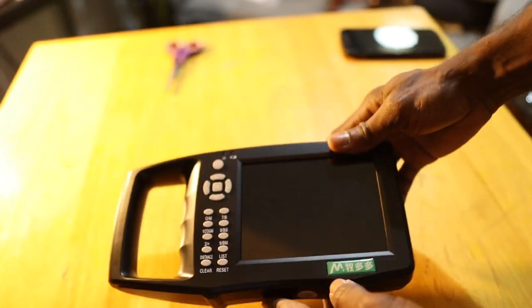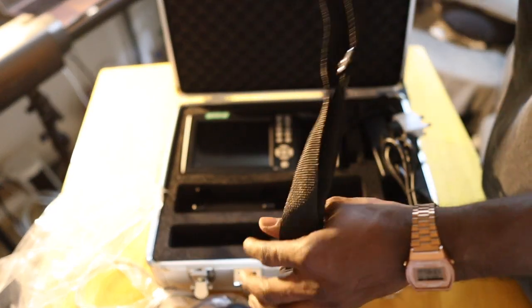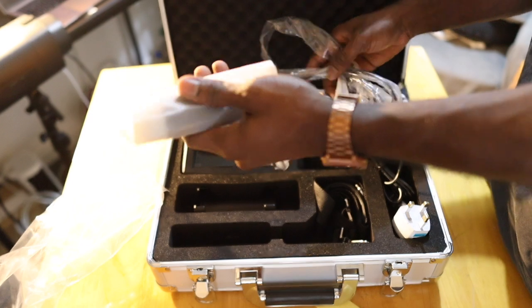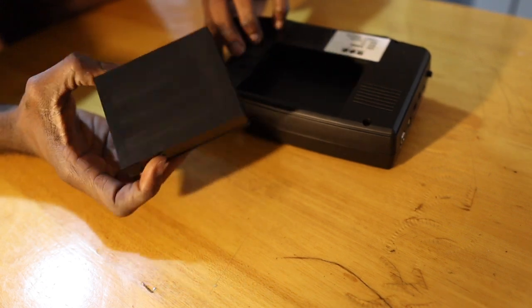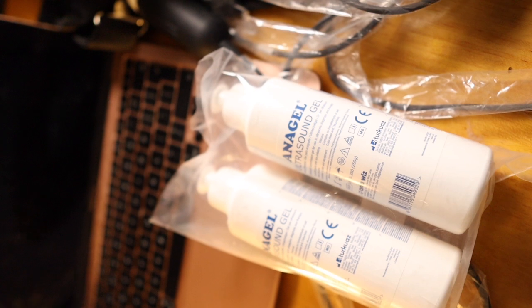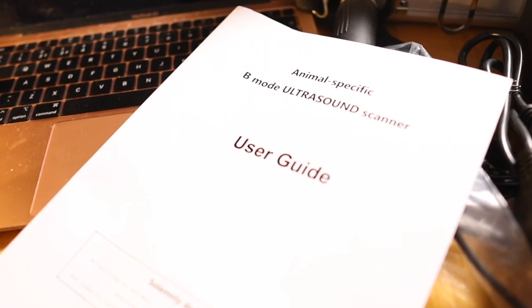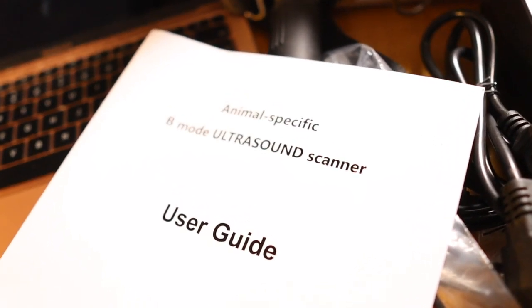It can detect pregnancy, the age, sex, heart rate, and even the gestation period of your farm animals. It comes with a carrying strap so you can hang the device on your neck or around your waist. This is the mechanical probe — either a rectal or abdominal probe depending on the animal. The package also includes an external battery, battery charger, power adapter, and a bottle of ultrasound gel. We had to buy our own gel separately due to flight policies, and of course there is a manual showing you the special features and how to use the device.